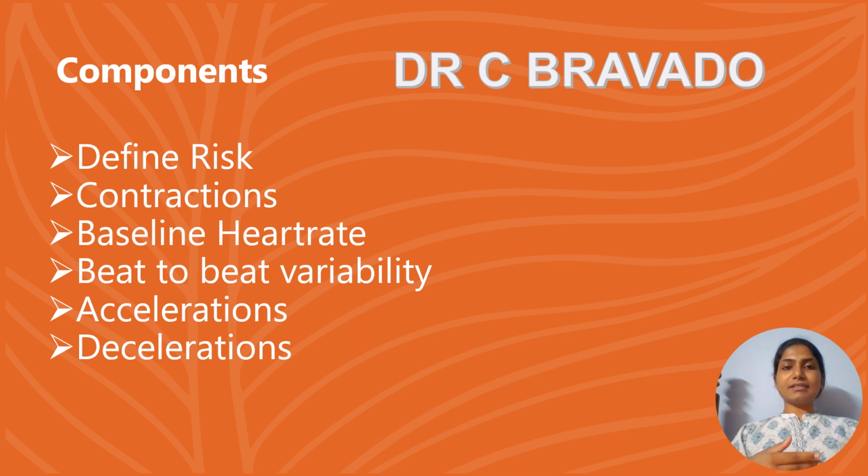One more very important indication is when the mother presents with reduced fetal movements. She tells you that she has decreased perception of fetal movements. Then we check her heart rate, and if it is good, we take a CTG strip. So even in fetal growth restriction and reduced fetal movements, this antenatal assessment is very important.